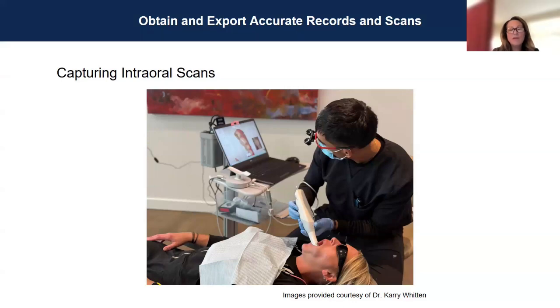They really, I think they require 3 different photos. The smile, and they don't require like the mirror shots. But I really think it's important for any aligner company to see an actual patient's face. But that's just me.